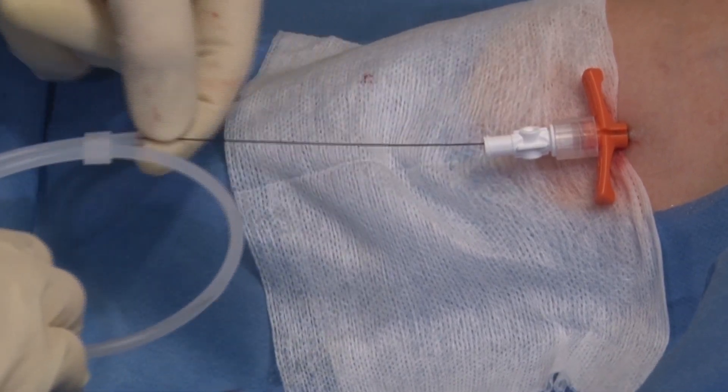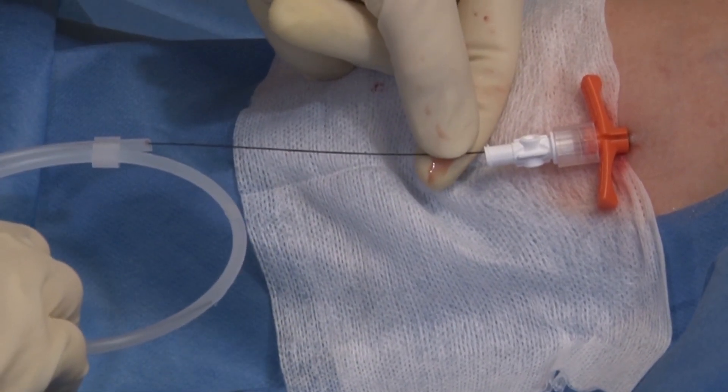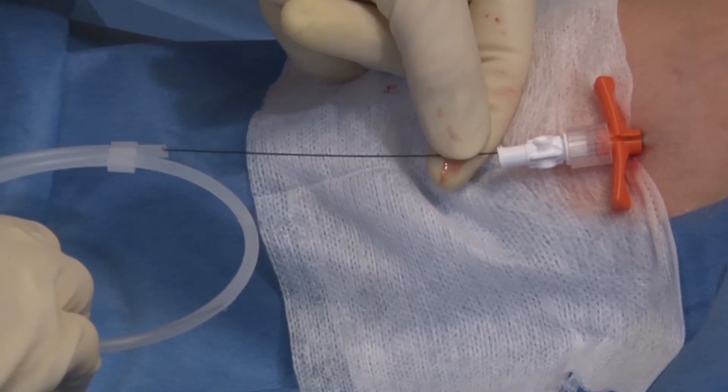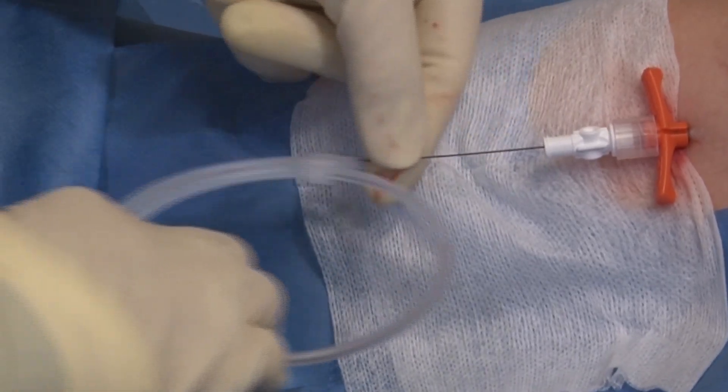You can remove the wire at this stage and occlude the dilator to reduce the risk of air embolism.